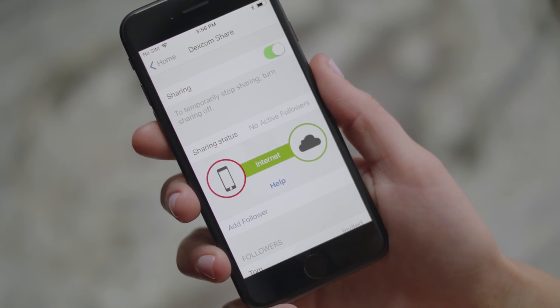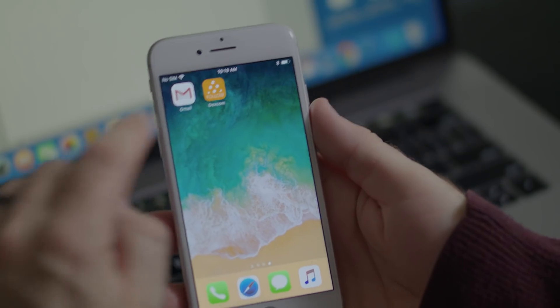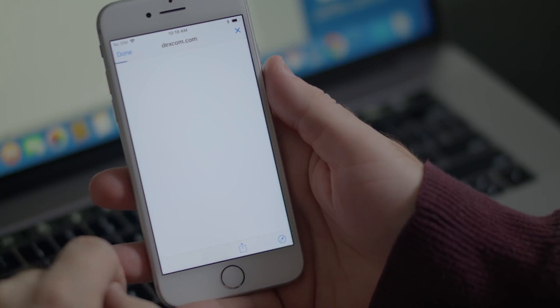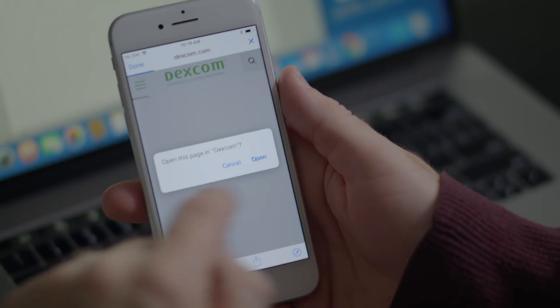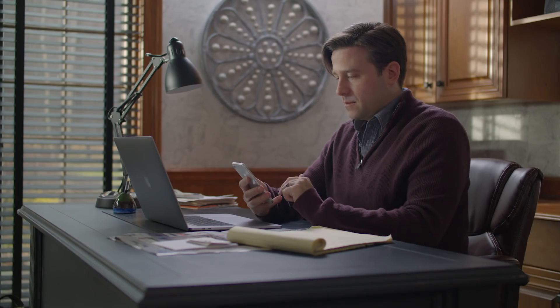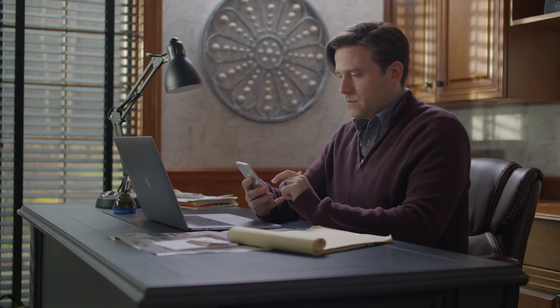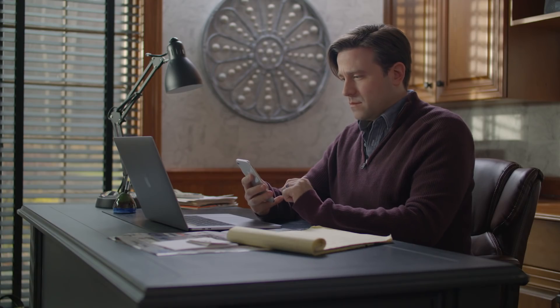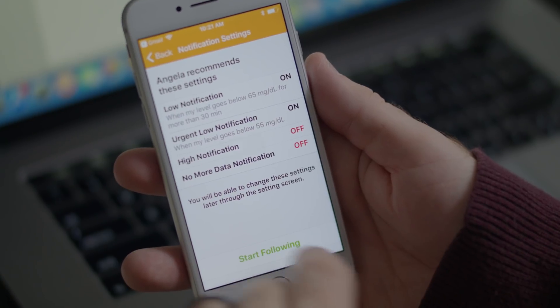My husband just received an email from me. This email gives him two options: to download the app from the app store, or start following. He already downloaded the app, so he'll click "Start Following." The invitation takes him into the app. In the Dexcom Follow app, he can go through any information screens and accept the invitation. He accepts the invitation and starts following me — he can now see my glucose information.